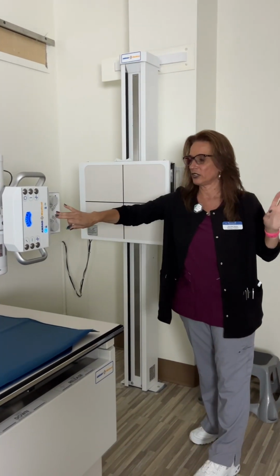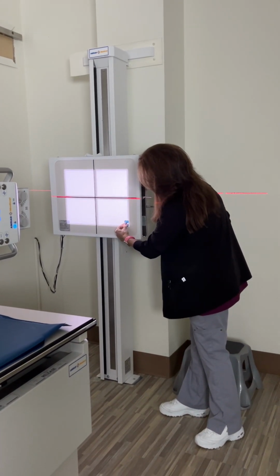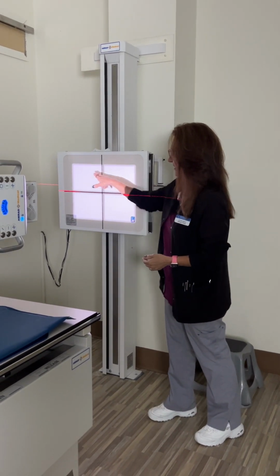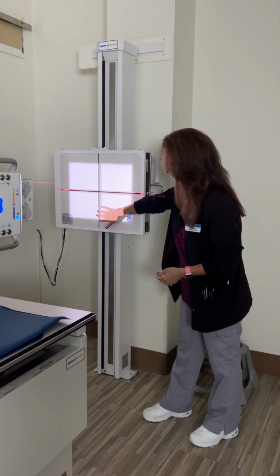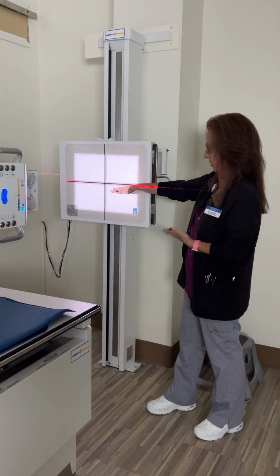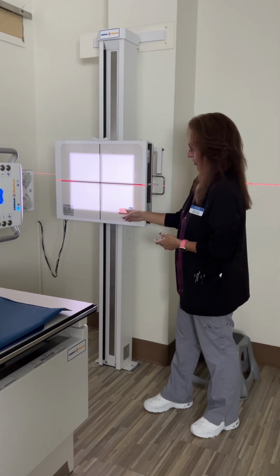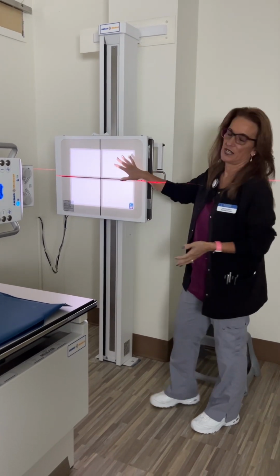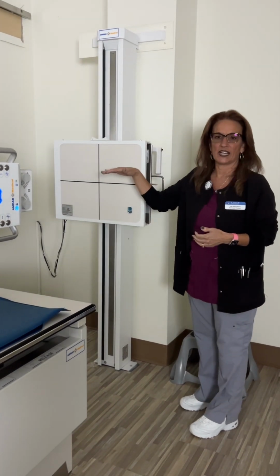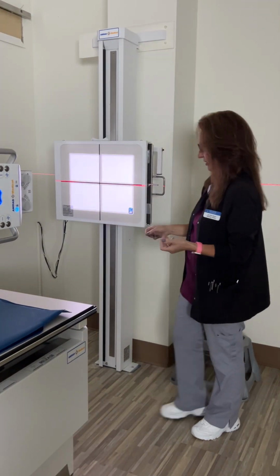So it's left marker. So this is my left side. The patient will be facing out, and the marker is going to go in the lower left corner because the pertinent anatomy in this is diaphragm, and ideally diaphragm would be up here, and then you would have abdomen. If when you shot the image your diaphragm was too low, then you could potentially need to get another image crosswise with overlap. But if it's done appropriately, a lot of times just that top one is fine because all you're trying to do is demonstrate diaphragm and air fluid levels, and air can only rise as high as the diaphragm. So this is what we're looking for.